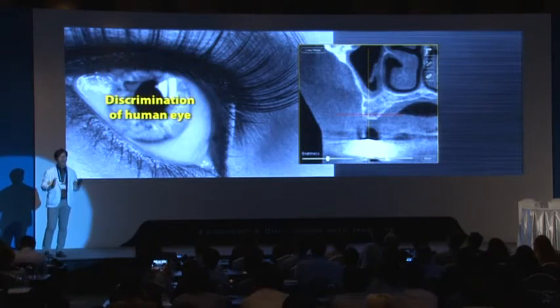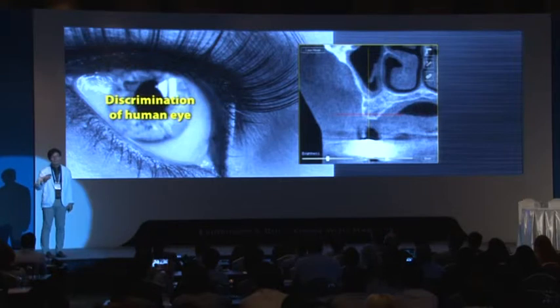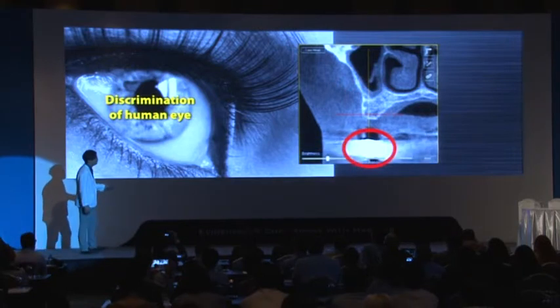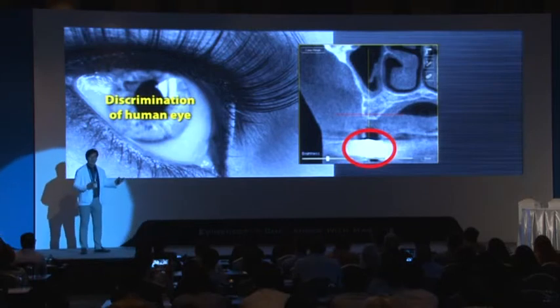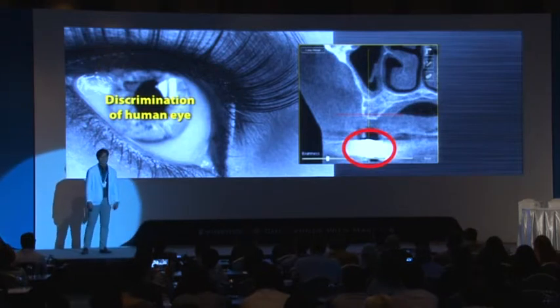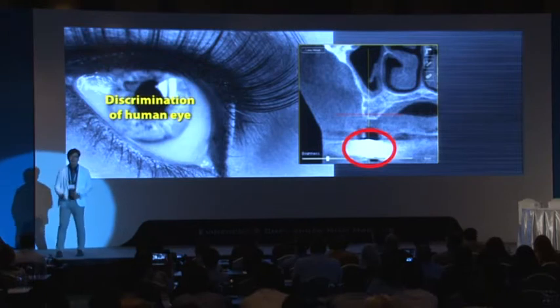Because our human eye distinguishes grayscale only 16 degrees. But in these CT films, 256 grades exist. So let's look at these circles. Can you distinguish the grayscale in this circle? Using my eye, I only see white colors. It means I cannot distinguish the grayscale perfectly.